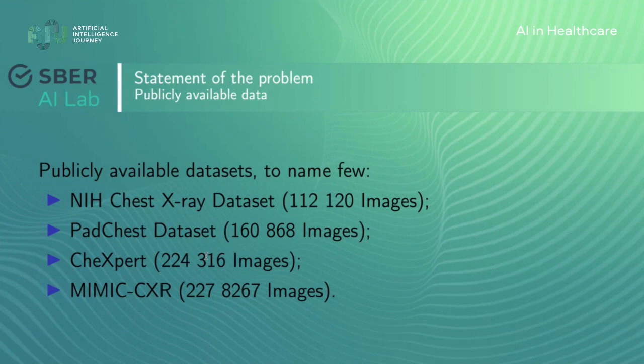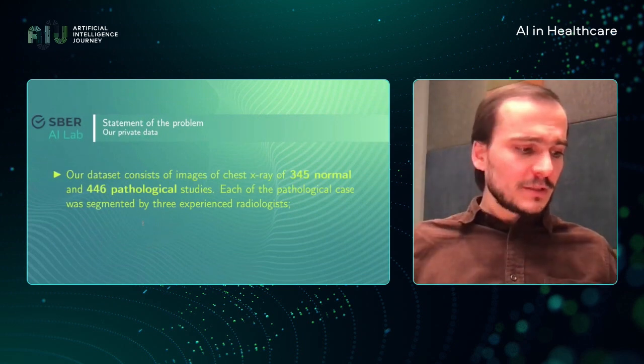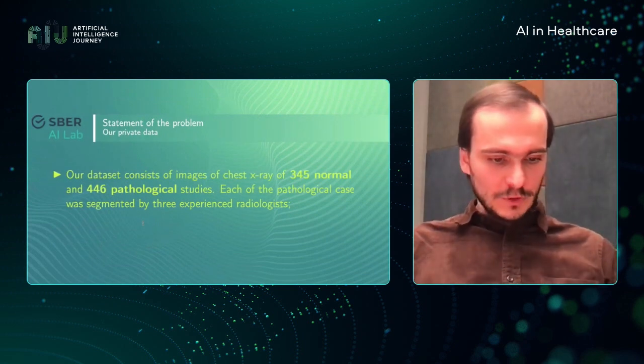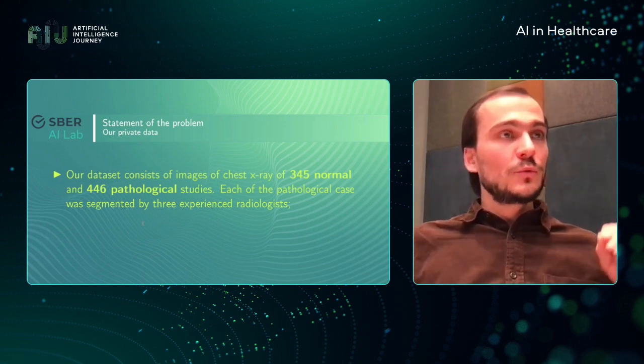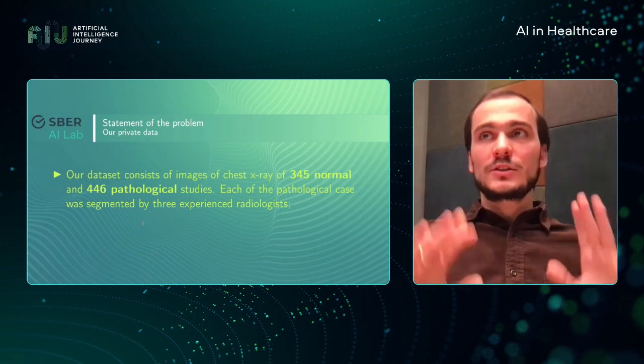They either have poor segmentation marking or spatial markings, or in the best cases, they just underline the rectangular area symbolizing the focus of pathology in the lungs, and also they're missing the images of both projections, only using a single projection, either frontal or lateral. Our data sets are unique in that regard. We're going to upload it online soon, and it will be publicly available.